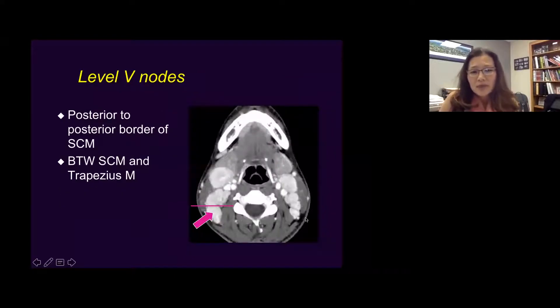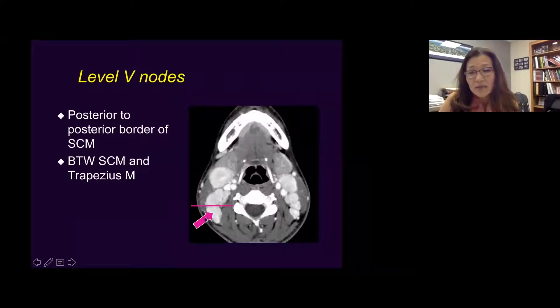For level five lymph nodes, you use the posterior border of the SCM to draw the line, and anything posterior to that — far back between the sternocleidomastoid muscle and the trapezius muscle — would be level five lymph nodes.